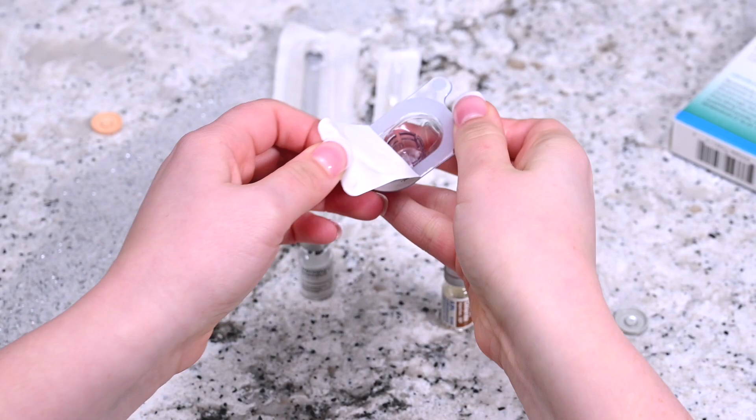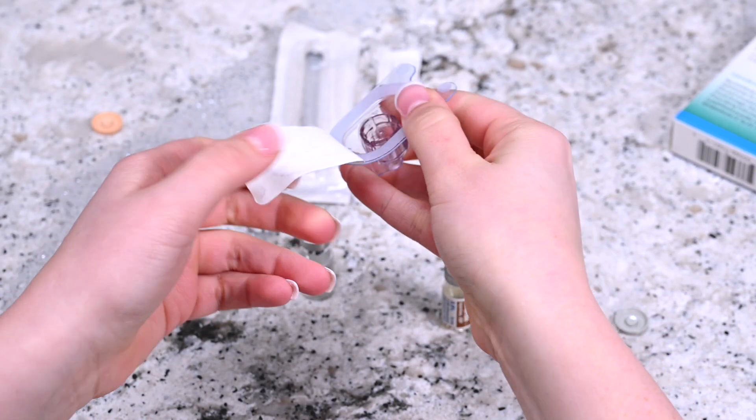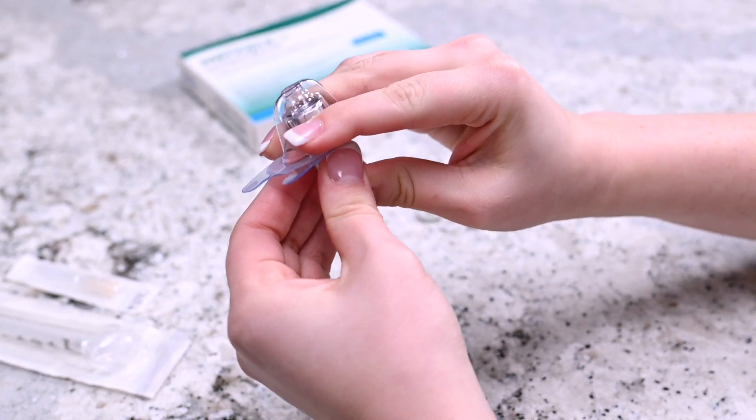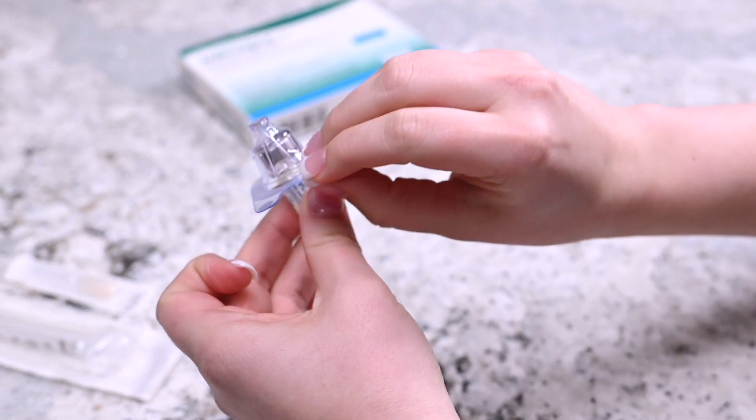Put back the top of the q-cap packaging but do not remove q-cap from packaging. Puncture the top of the sterile diluent with a q-cap needle. Remove the remaining plastic packaging.